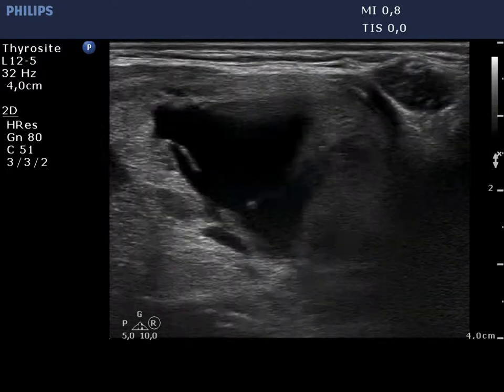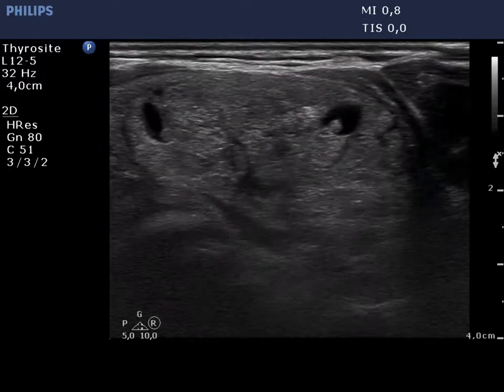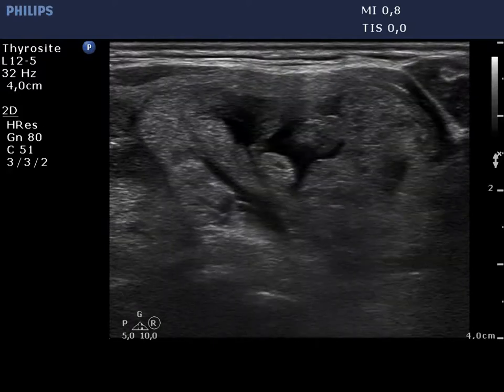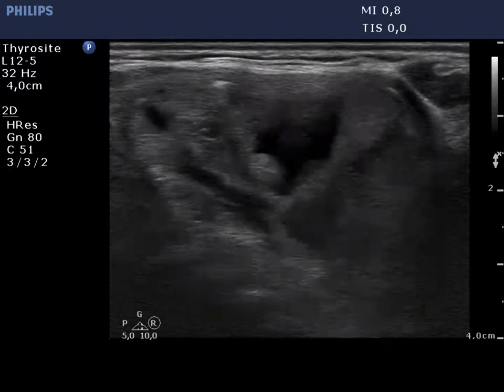Now the isthmic part of the nodule is presented. It is a central type cystic lesion.